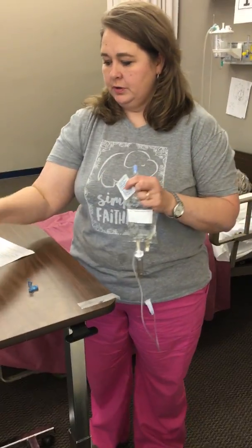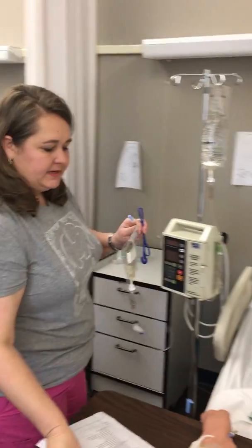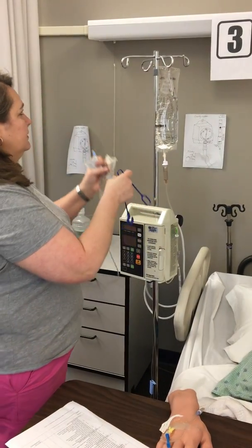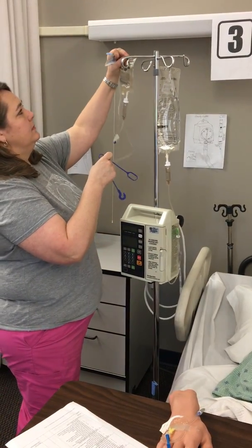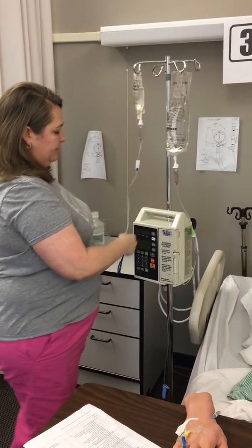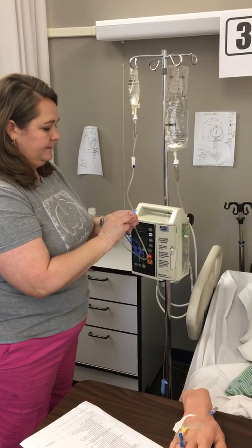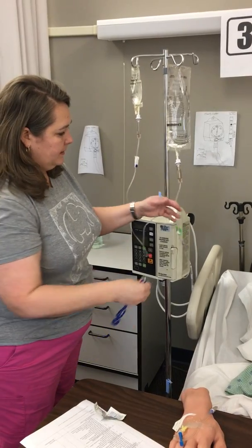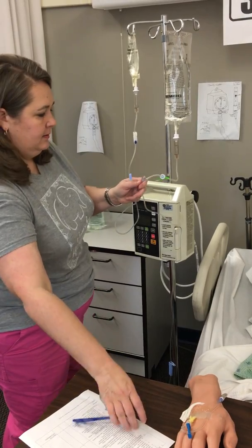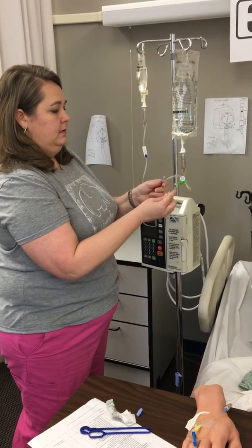At this point I'm going to go to my patient's room with my MAR, and of course we're going to verify our patient and perform all of our correct medication checks. I'm going to hang my piggyback bag up here on my pole, stop my primary solution, swab the port highest — closest to the bag — remove my cap, and connect.